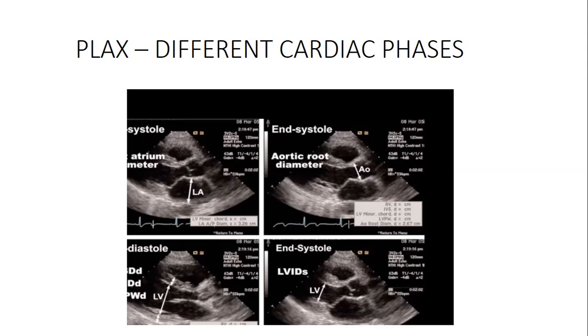The question is, what is the importance of PRF? When the PRF is high or low, what does it mean? There is a button called PRF on the keyboard.